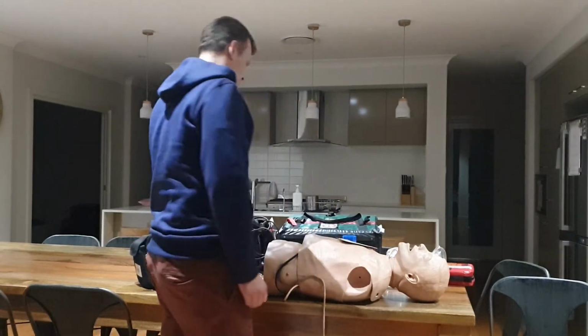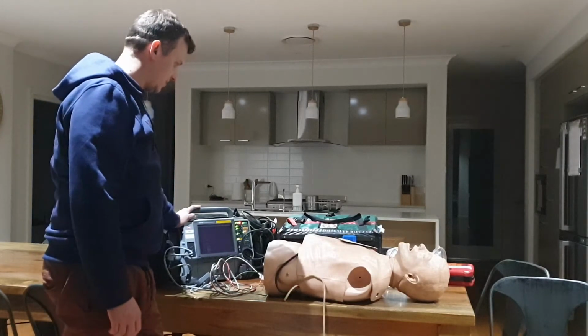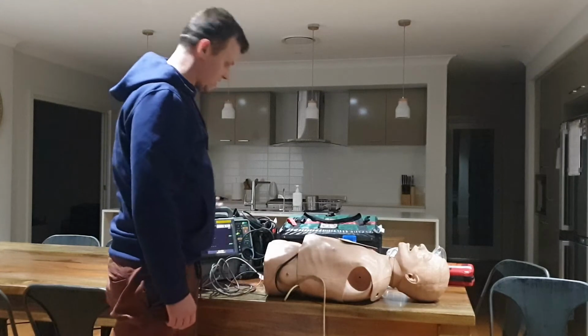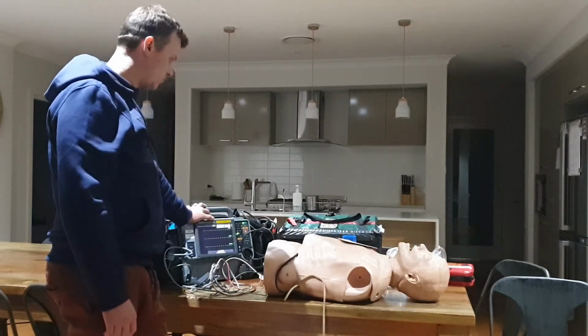Once that's done, you want to power up your LifePak, once it's all connected and hooked up. Now, when it powers on, you want to synchronize, and you want to make sure it's synchronized to the R waves of the ECG waveform.